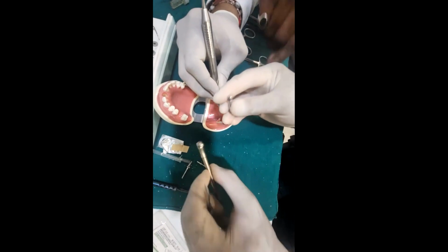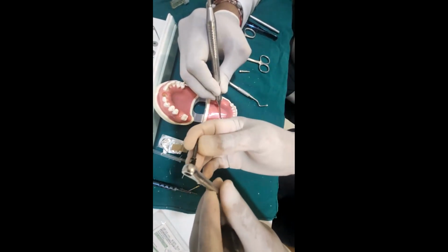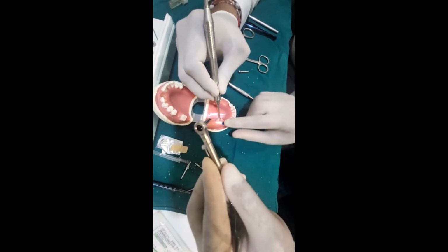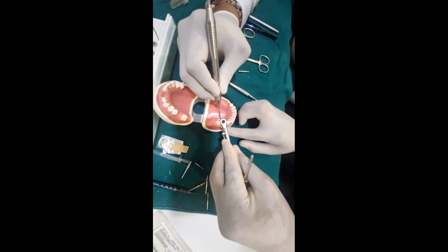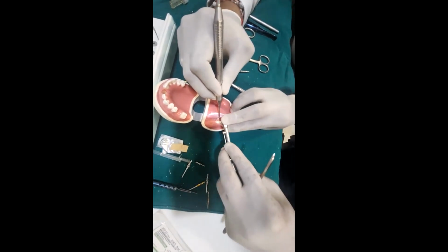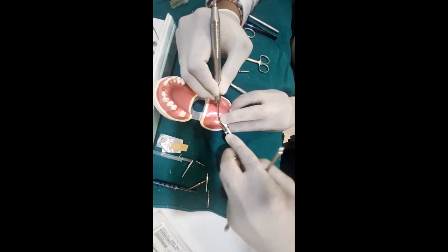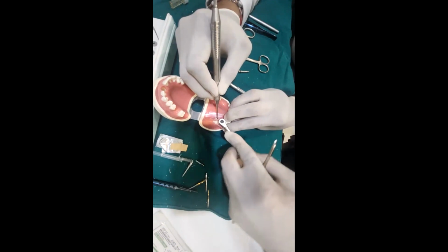I will connect that in the in direction. It's written in over here, and this is out. So in direction, you will slowly torque the implant at a very slow speed.